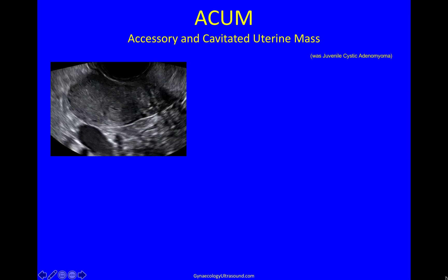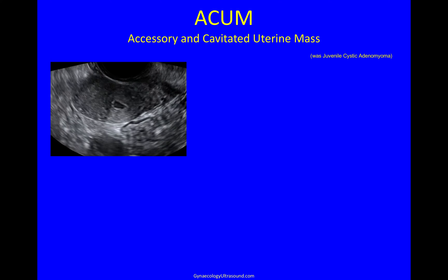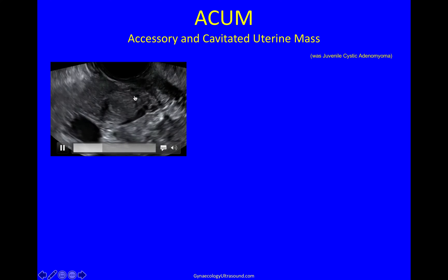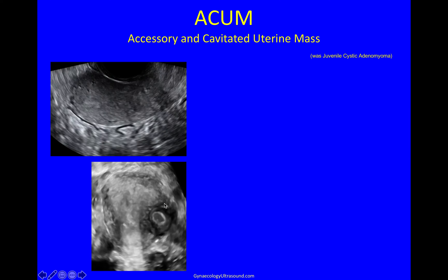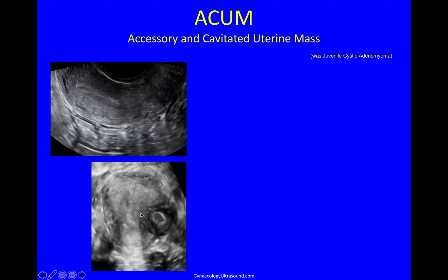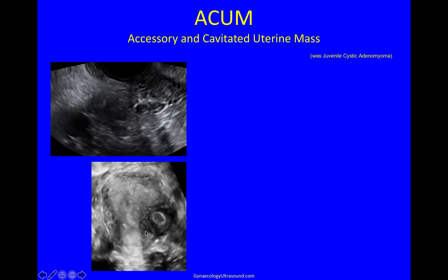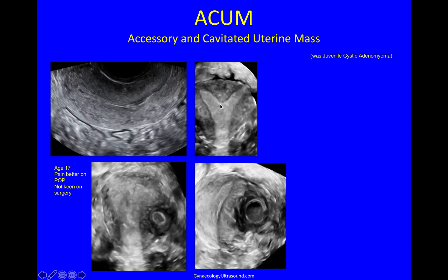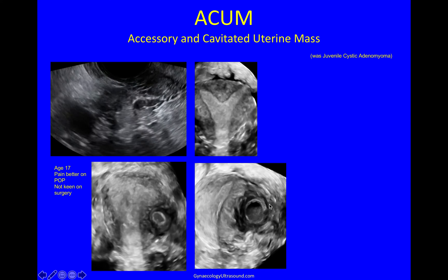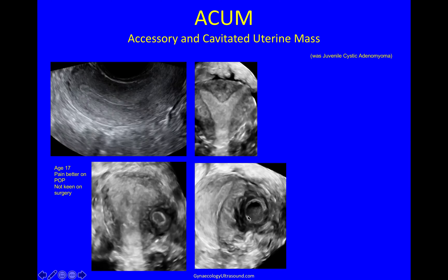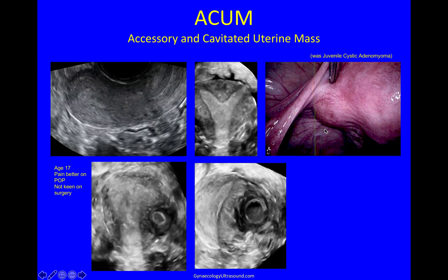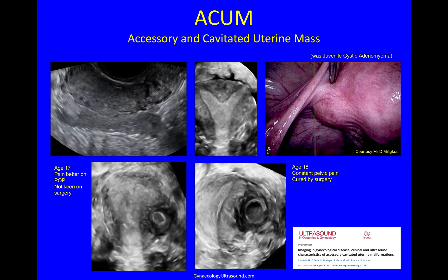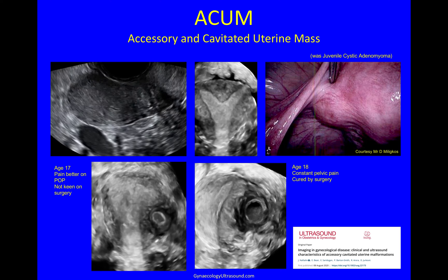This takes us to a new entity called accessory and cavitated uterine mass (ACUM), previously called juvenile cystic adenomyoma. This 17-year-old girl presented with intense dysmenorrhea. On 2D there is a small mass to one side of the uterus, and on 3D — slightly behind the best plane for the endometrial cavity — you can see this little mass. She was managed on the mini pill. An 18-year-old with a slightly arcuate uterus had a similar cystic mass in the myometrium with internal hemorrhage; she opted for surgery, the mass was removed, and her pain was cured. A newly published paper provides further detail on AcOMs.